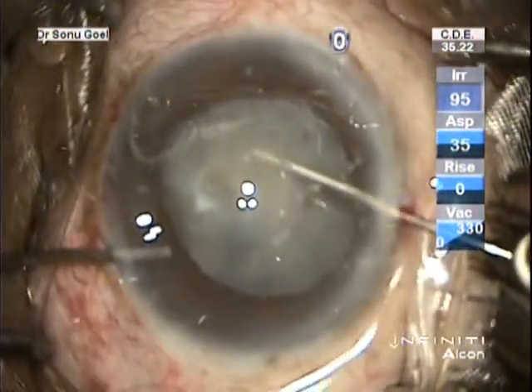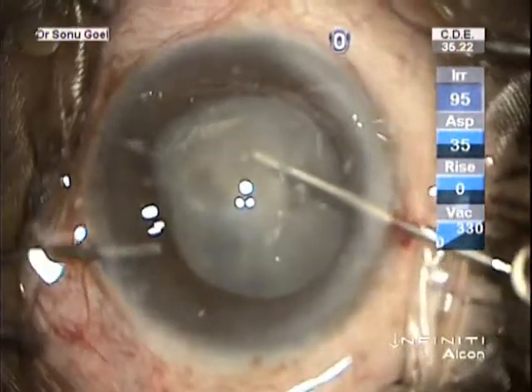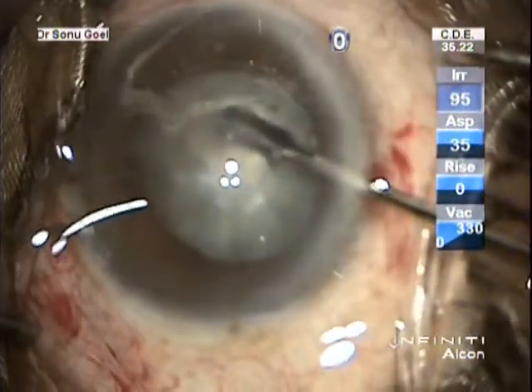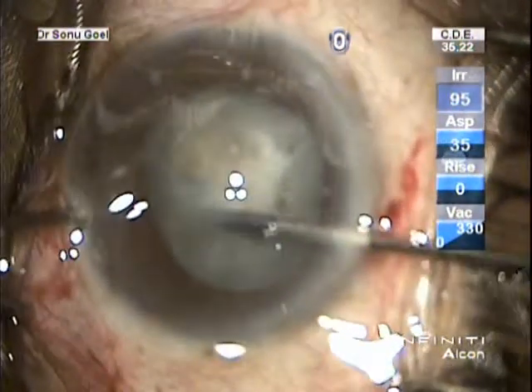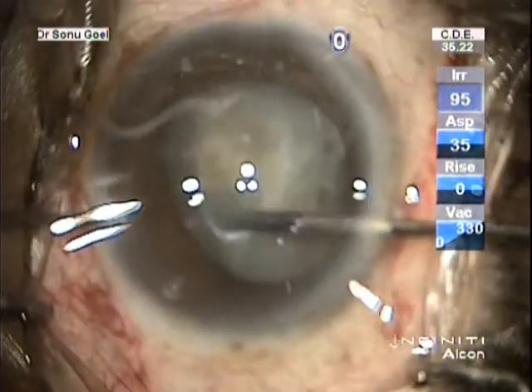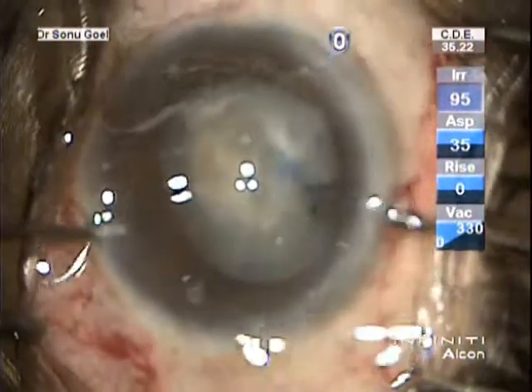Note is made of how the high intralenticular pressure and the fluid impedes the visibility, but continuous putting in of the viscoelastic helps in maintaining the flattening of the anterior capsule instead of it being convex. So this is held with a micro rhexis forceps, and the rhexis can then be gently completed.